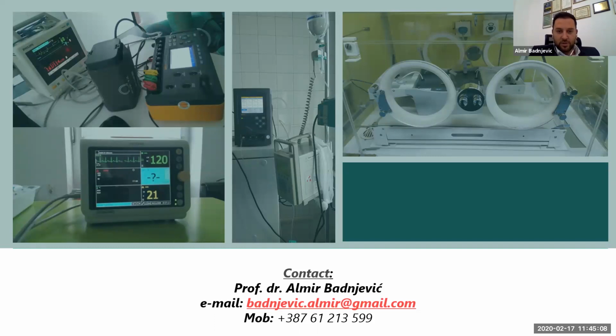Here is one question also about how this verification is different from what biomedical technologists perform as a part of their routine maintenance work. Well, routine maintenance of medical devices is something written by the producer, by the manufacturer, in fact, and that is what they are checking, what they are doing there. For example, in routine maintenance, they should first of all check, they call it auto check, independent from device to device. They are checking all the points which are written there.